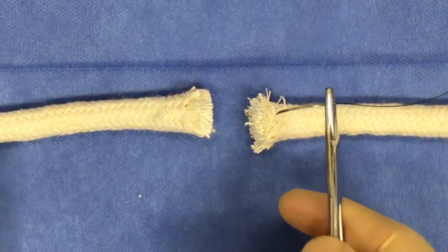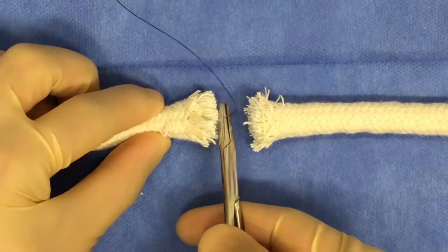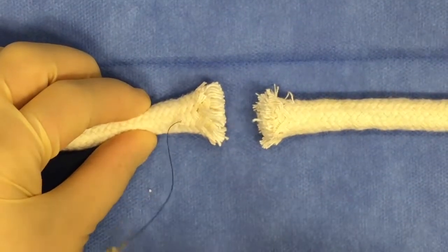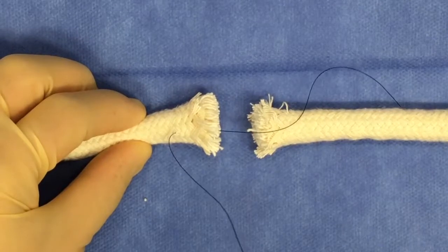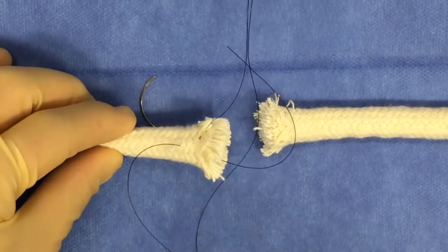You begin with the 2 ends of your lacerated tendon. Now, assuming this is a tendon that's kind of rounded in shape. For a flat tendon, you might just simply apply a horizontal mattress suture. Your first throw of the suture will be intratendinous through the lacerated end of the tendon and will exit through the dorsal surface of the tendon. Now, you'll typically pick either the radial or ulnar side to throw the first suture.